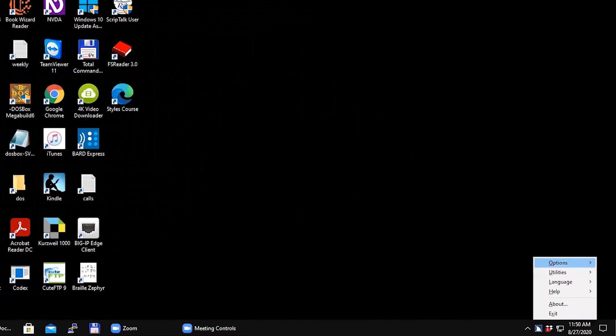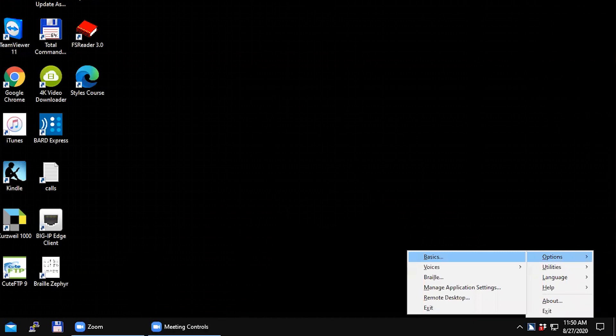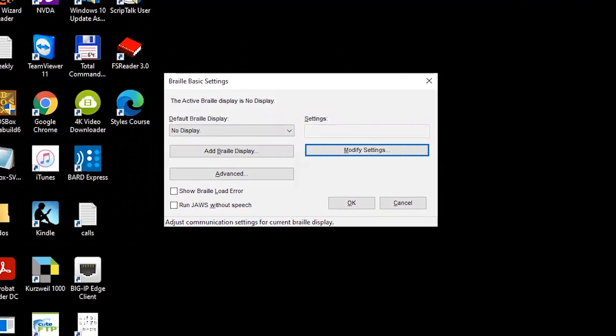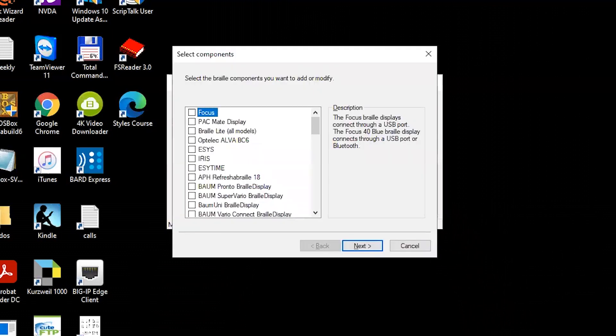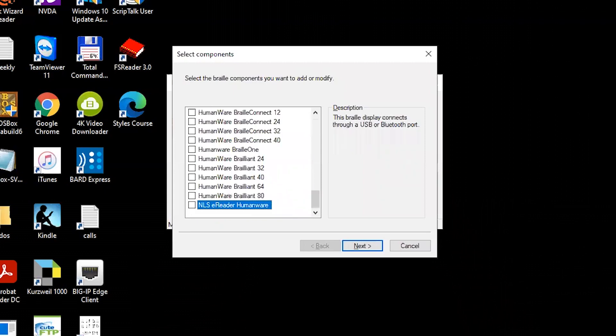Now on the computer, open the JAWS control panel, select Options, then Braille. Tab to Add a Braille display and press Enter. A list of possible Braille displays will appear. Type the letter N until you reach NLS Braille eReader HumanWare. Press the space bar to check the box.